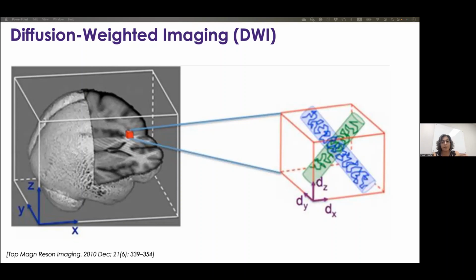On the other hand, diffusion-weighted MRI methods are being developed to detect the presence of tumor boundaries that may be different from those seen by more conventional methods. Diffusion-weighted MRI allows non-invasive measurement of translational motion of water in living tissue, and it is sensitive to tissue microstructure.